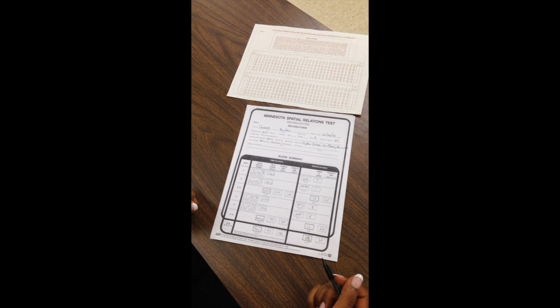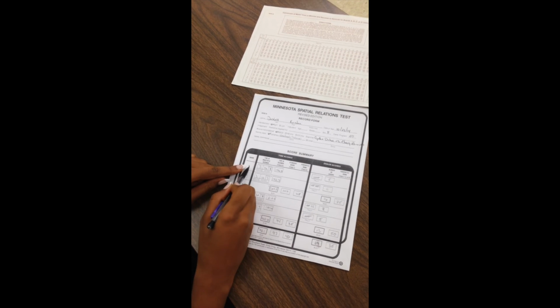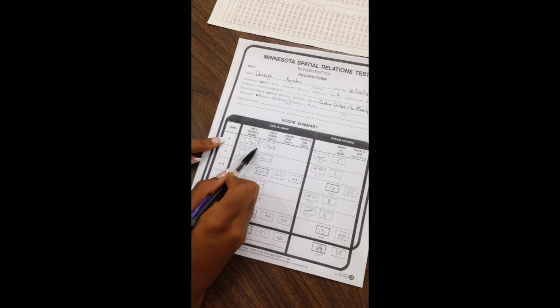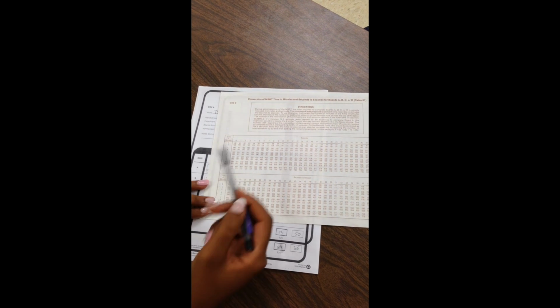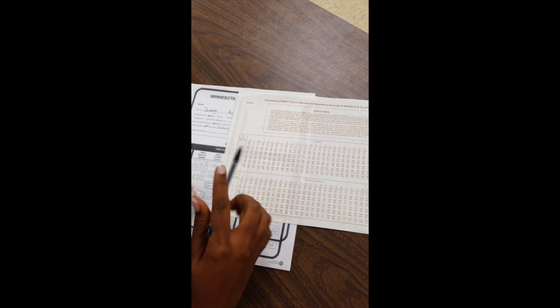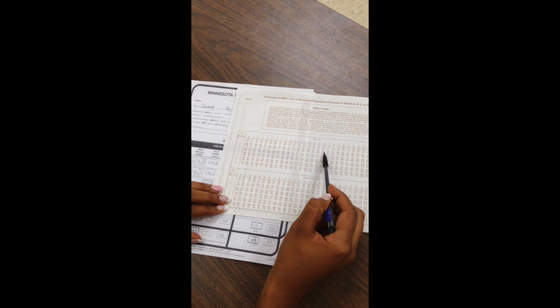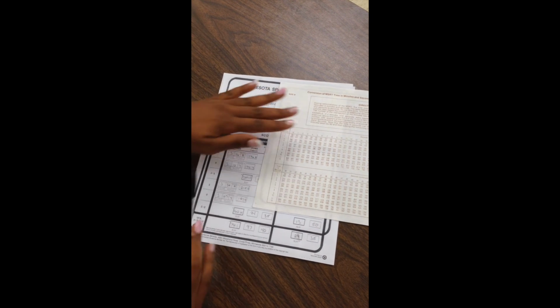Now we shall review how to score your assessment. On board A, it took Kristen 3 minutes, 16.8 seconds to finish the board. Now you have to convert your time from minutes to seconds. If you're unsure how to convert this, or you want to double check your work, there's a convenient conversion table on the back of the recording form. You'd find your minutes, and you would cross-reference it with the number of seconds across the top. It's 3 minutes, 16 seconds. You have 196 seconds, and then you add in your tenths. So we have 196.8 seconds.